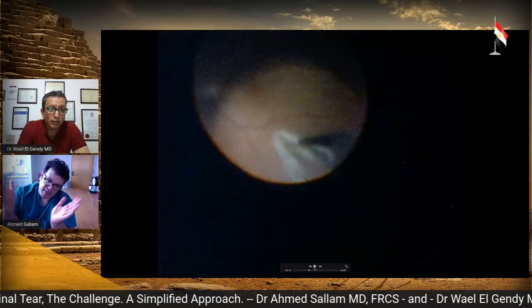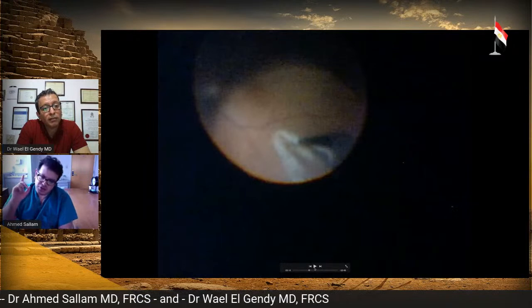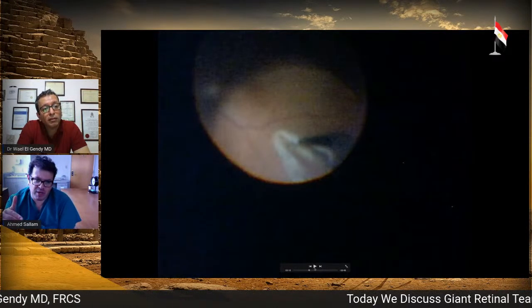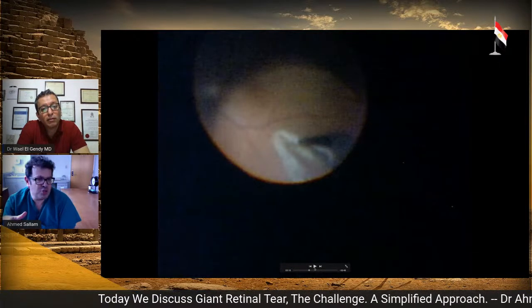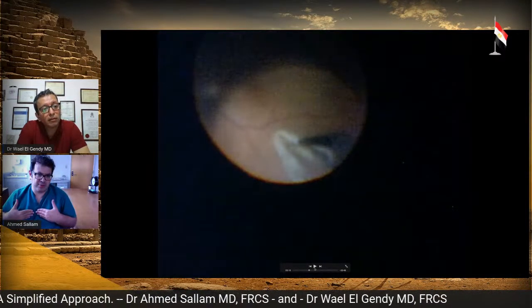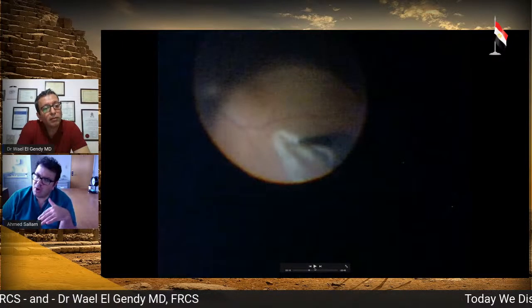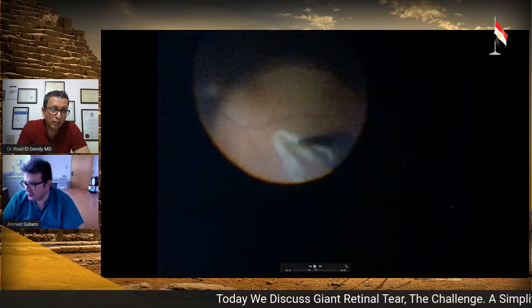So what I do is I get the oil or I get the air. Same thing, you get the air first coming, and then you go to the break. And you want to be actually on the anterior edge of the break. With silicone oil, you can be at the posterior edge of the break. It will work well. But ideally, you want to be at the anterior edge of the break to catch the fluid early out. Right? So here I'm at the posterior edge of the break. But the more ideal, you'll be more at the anterior edge of the break to catch the fluid earlier.